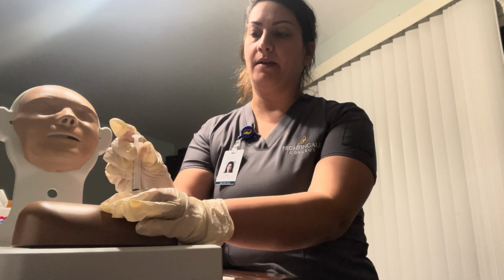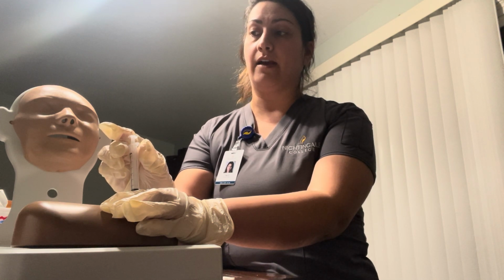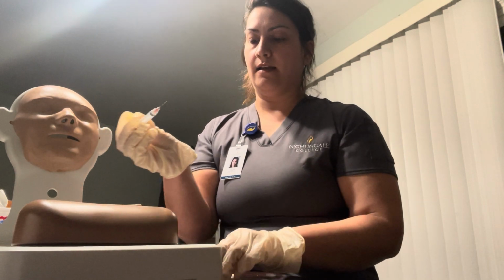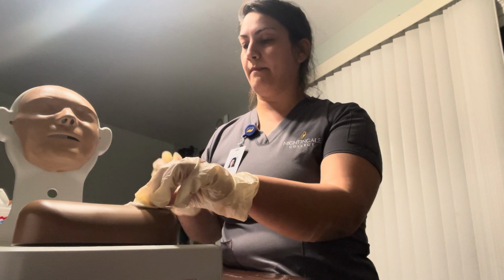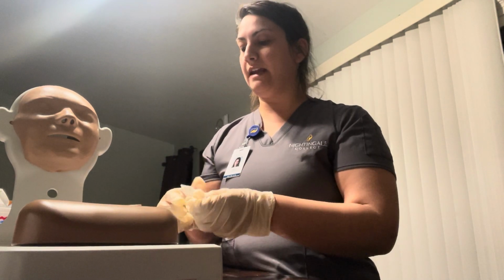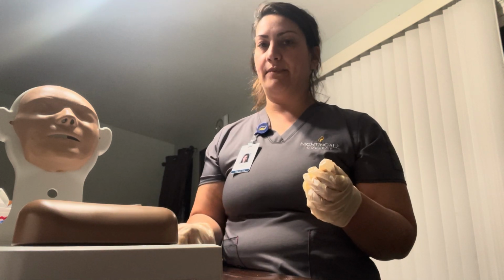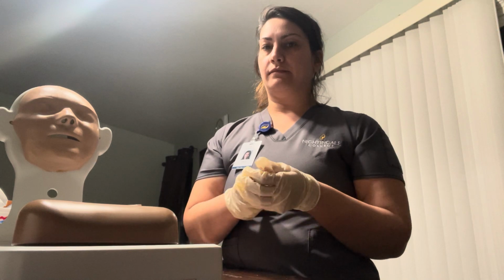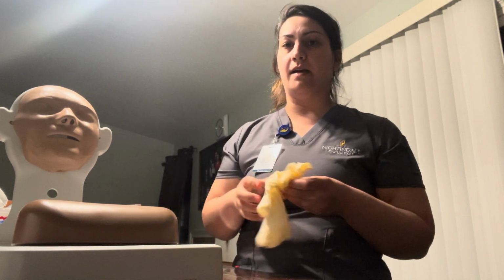Once I do that, I'm going to leave it in for 10 seconds. 1, 2, 3, 4, 5, 6, 7, 8, 9, 10. I will pull back. I will discard my needle, and I will put the gauze on top, and I will apply a Band-Aid if needed. Next, I won't recap the needle. I will just toss that. I will take off my gloves. I will do hand hygiene, and I will document my procedure.